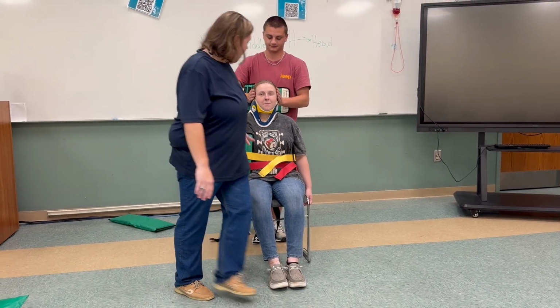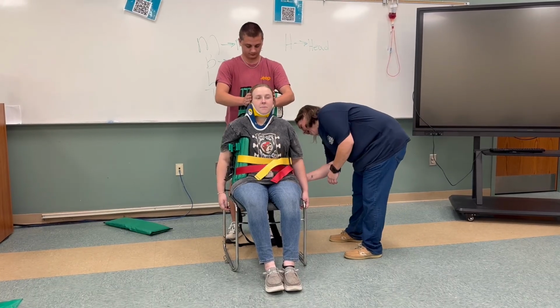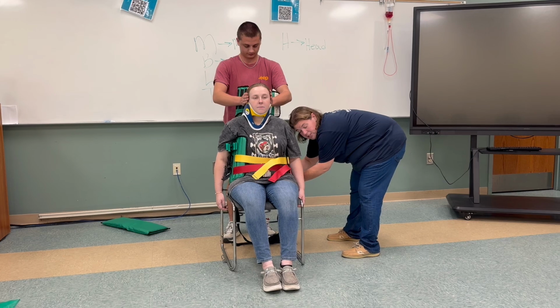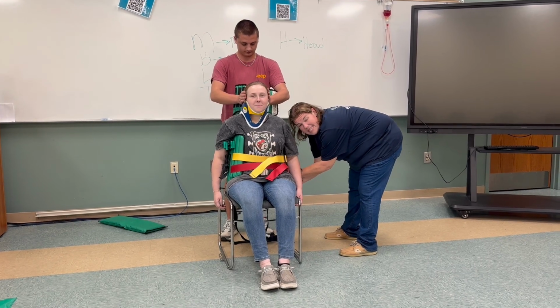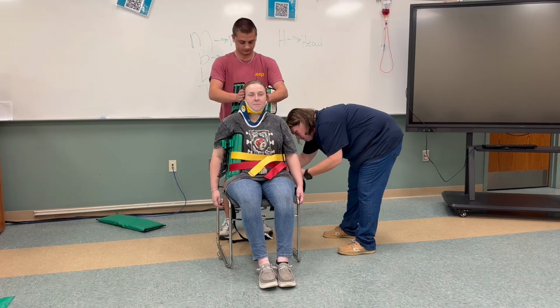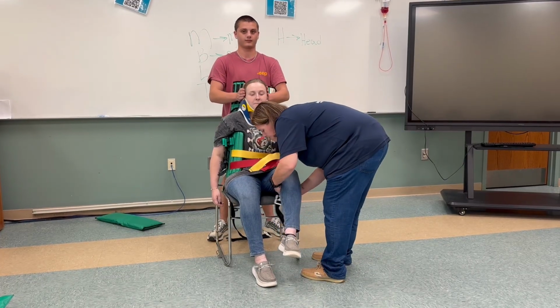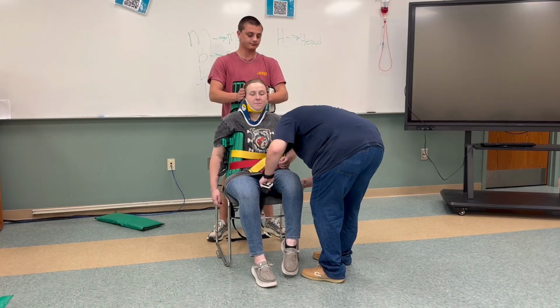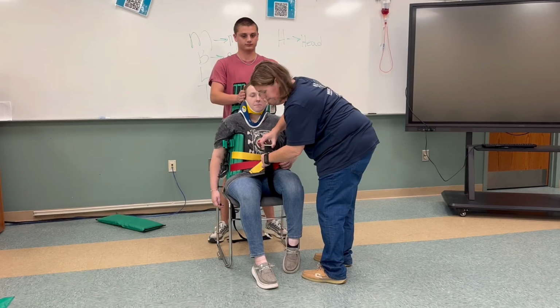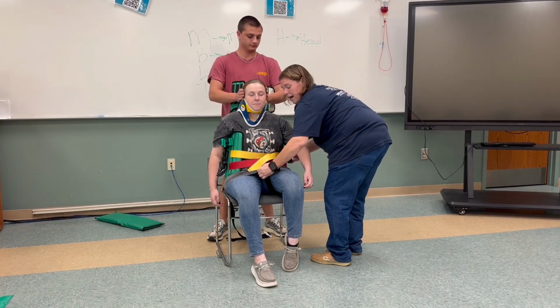All right. So we have middle, bottom. The next will be legs. Now this is where you're going to get really up close and personal to your patients. And just like when I teach anybody how to do this with males, you have to be super careful. So you will go up under the leg. Okay? And it will go right in the groin. And you will come back around, and there's also a strap for your legs.